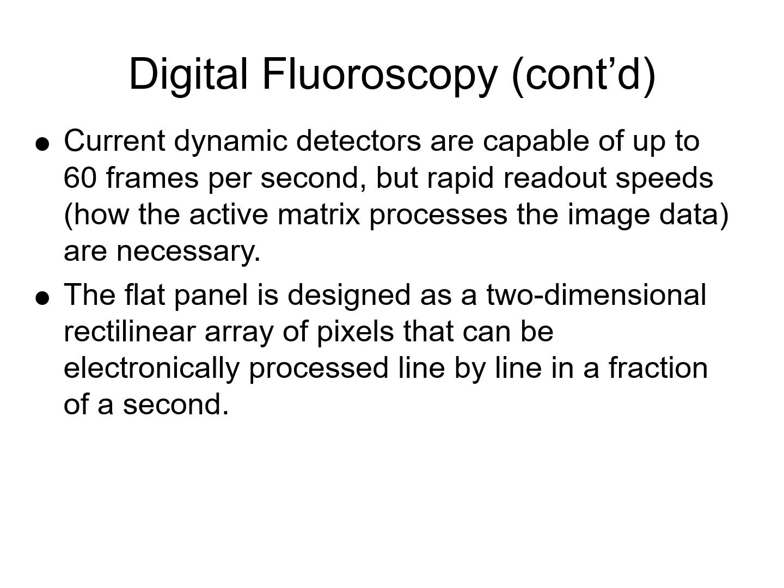And so that's the fundamental difference between a flat panel fluoroscope detector and the flat panel DR image receptor that you're using in conventional radiography: how fast can it read out an image and broadcast an image to a monitor. The digital fluoroscope can do that 60 times a second, which is very impressive. And I did mention this when I covered this the first time.